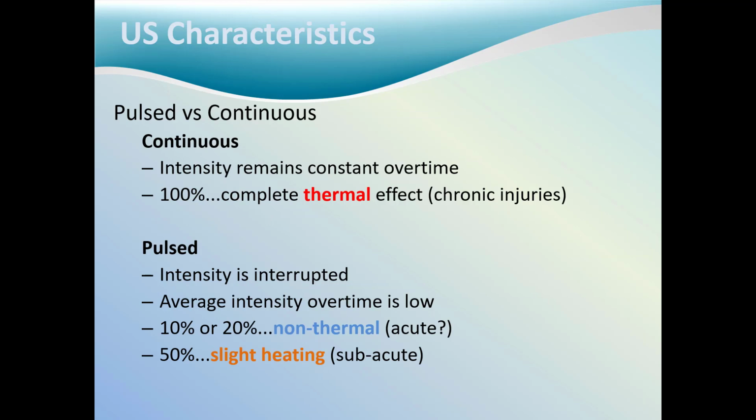Again, the comparison between pulsed and continuous ultrasound is important to understand. In continuous ultrasound, the intensity remains constant over time. The machine is 100% active, and therefore we receive thermal effects of ultrasound, which is great for treating chronic injuries. During pulsed ultrasound, the intensity is interrupted, and therefore the average intensity over time is low.